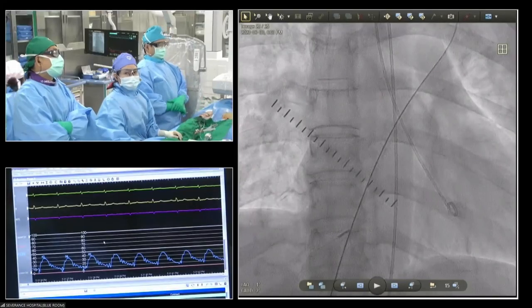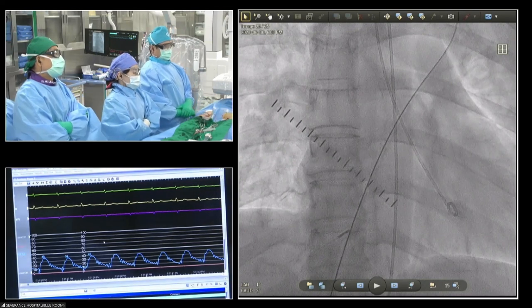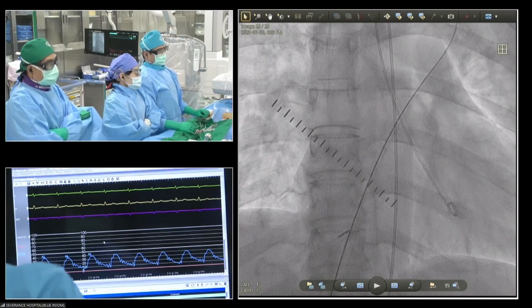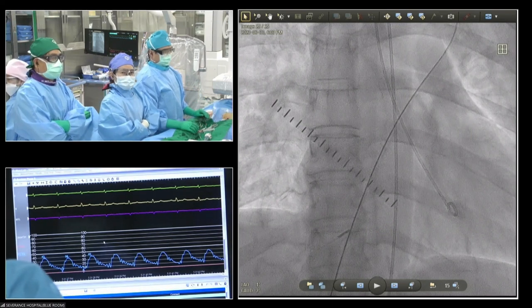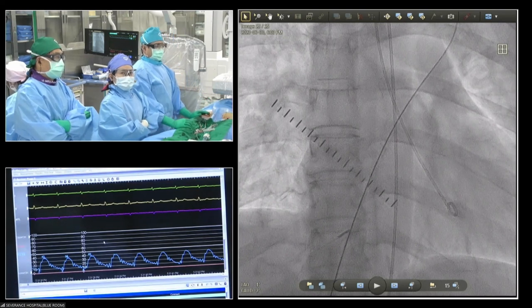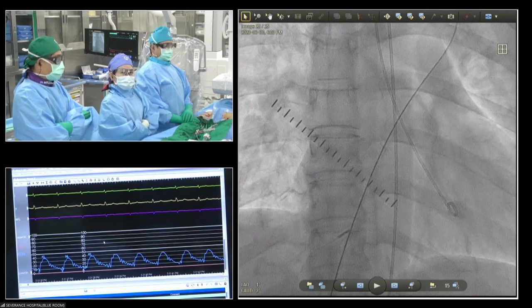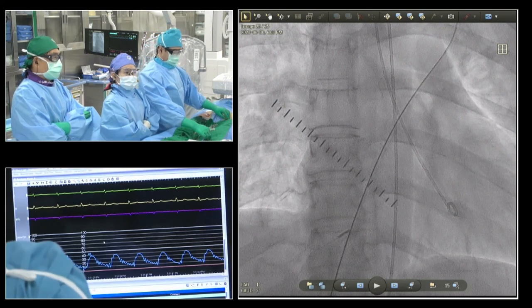So Peter, in a 58-year-old female patient, do you anticipate any concern in this patient? No, I do not. That's straightforward. Put a device in, and that's it. No, do you do a balloon sizing first, or not? Yeah. Well, actually, the default is balloon sizing. Different from TG there. Okay.